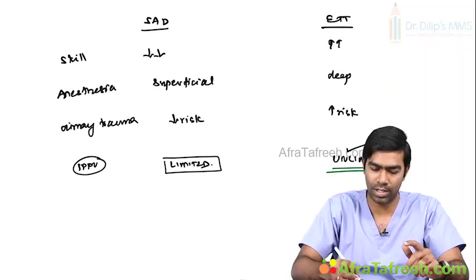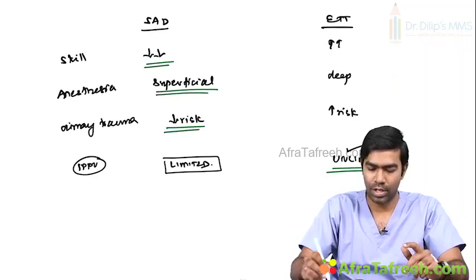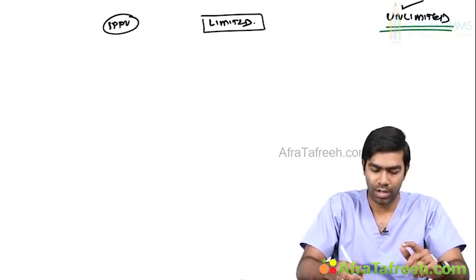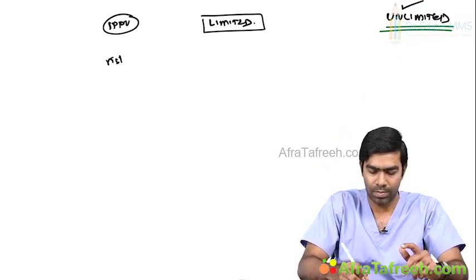They can provide a good cuff seal around the perilaryngeal area, but still it's not designed for this purpose, for a high level of intermittent positive pressure. But theoretically, any amount of pressure you can give in endotracheal intubation. So this becomes an advantage of endotracheal intubation. So the earlier three are the advantages of supraglottic airway devices, but this unlimited IPPV will become an advantage for the endotracheal tube.